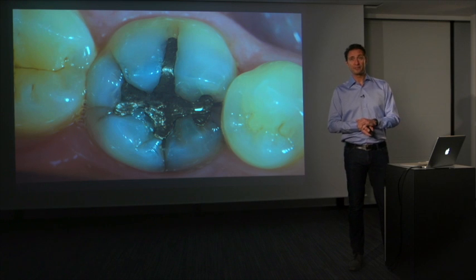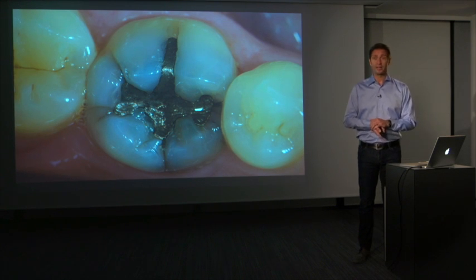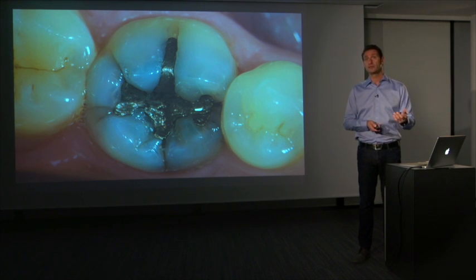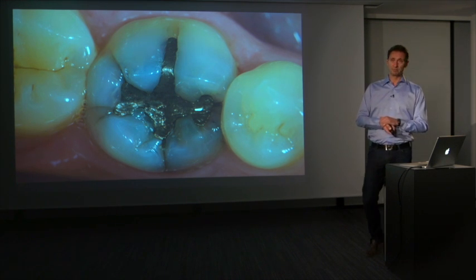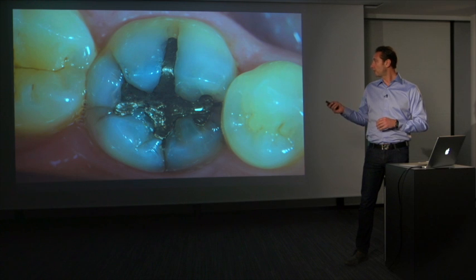And I think that we will let pictures do the talking for a few moments here, because one of the biggest examples is a small cavity. A small cavity restored using some amalgam some years ago, and as you can see, the amalgam is perfectly within the criteria for the use of amalgam. It's a very shallow cavity, it's not very wide, and still we see that there are some biomechanical issues. In fact, the material and the tooth are not really behaving well together, creating some severe cracks on the distal, on the lingual.